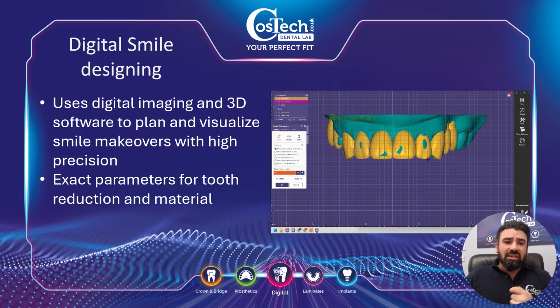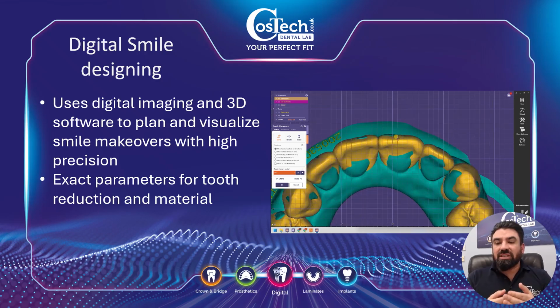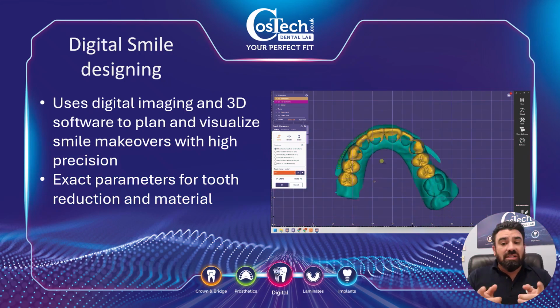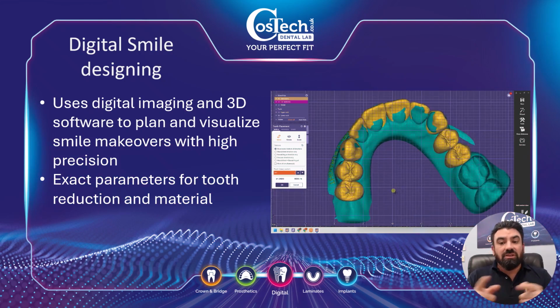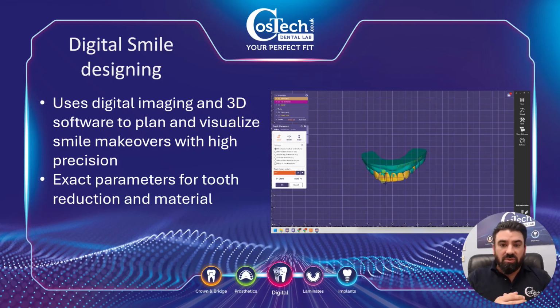Again, with the exact parameters of the tooth reduction, where we're trying to be as minimally invasive as possible, if a patient's got very crooked teeth and the patient just wants a perfect arch, we can say, if you're going to go for veneers or something, this is how much we can guide you, and say, you're going to need to take X amount of tooth material off. Then you might look at it and go, no, that's going to go too deep. Let's think of something else, and let's go down the aligner route and do aligners first, and then go for direct bonding or veneers.